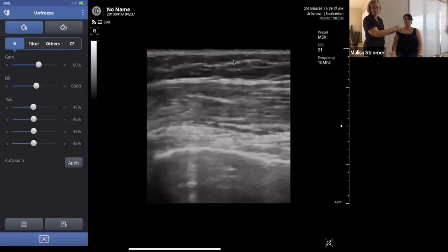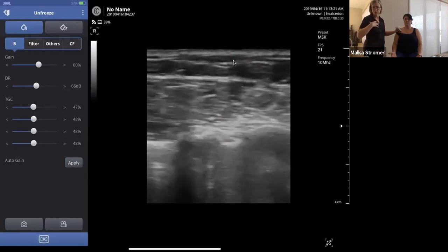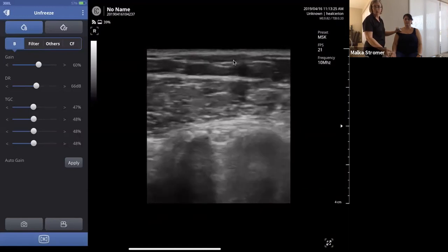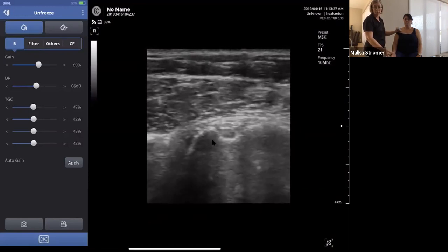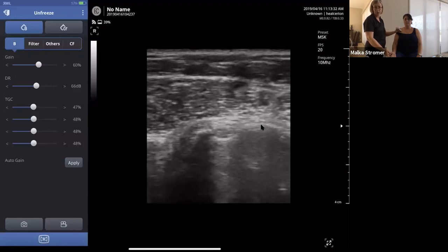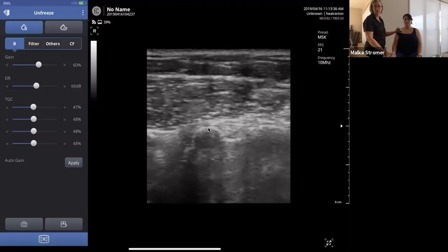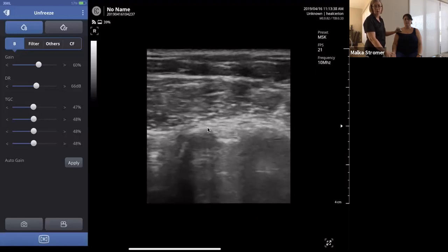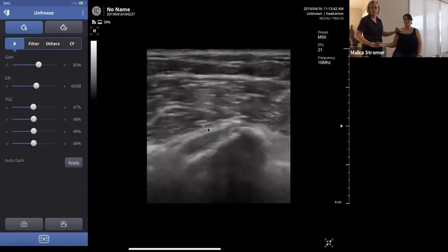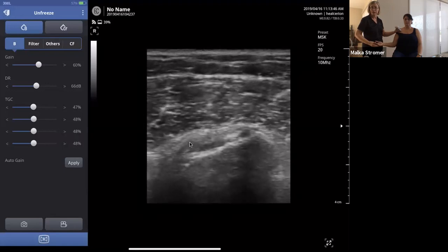All right, biceps tendon. Now we'll go to subscapularis, which will be the anterior muscle right here. So we have on the bicipital groove, the greater tuberosity to the right of the screen, where the supraspinatus will come through, the lesser tuberosity on the left-hand side. And if you're in the right position here, you'll already see the subscap coming in. I'm going to externally rotate her, and there's the subscapularis in a long axis view.